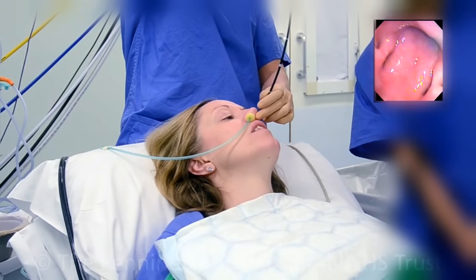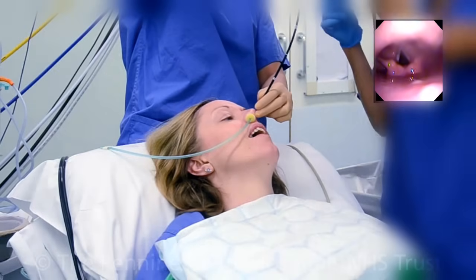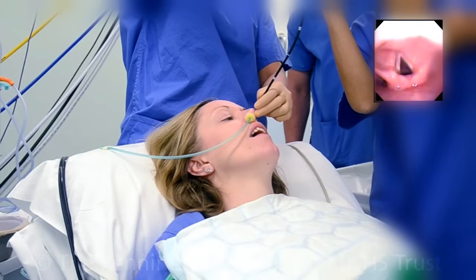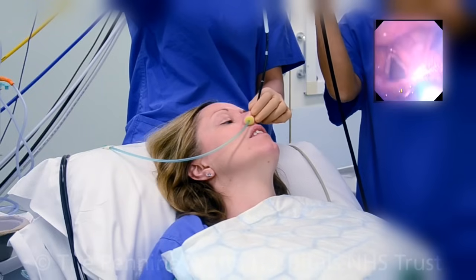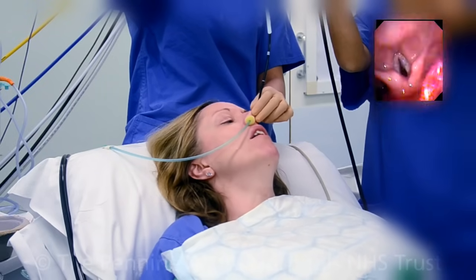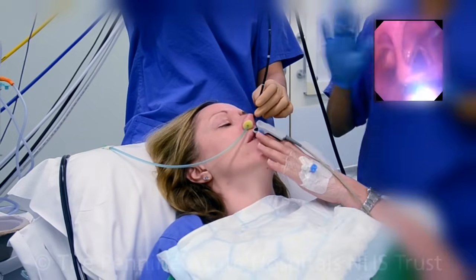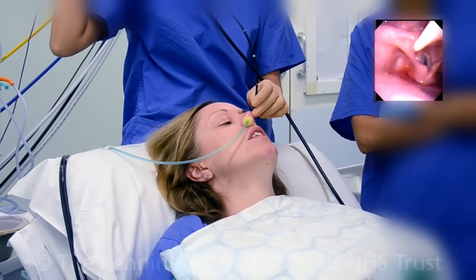You do not have to watch this. As the entrance of your windpipe comes into view, more local anaesthetic is sprayed into your throat via the camera. This can taste bitter and make you cough briefly. This is normal and coughing enables the local anaesthetic to spread.